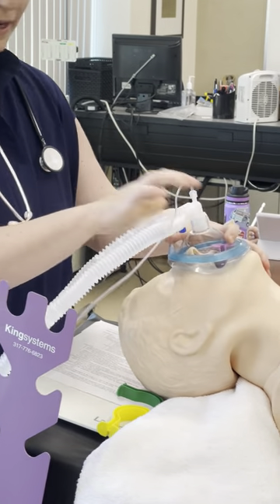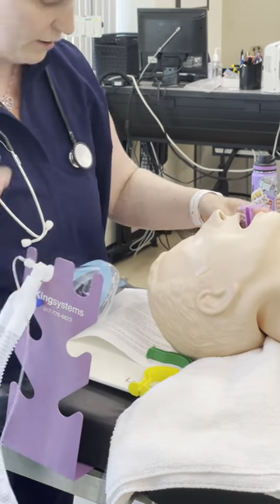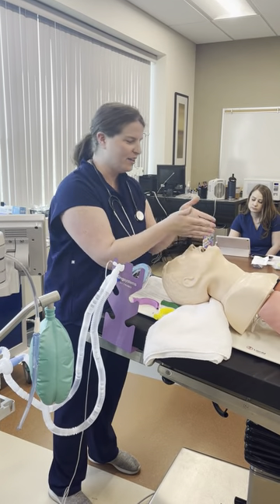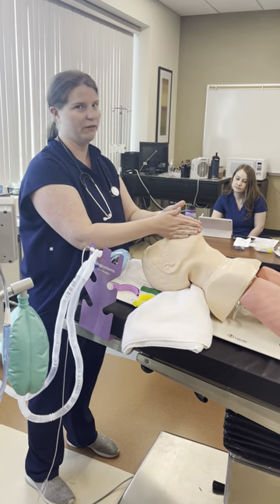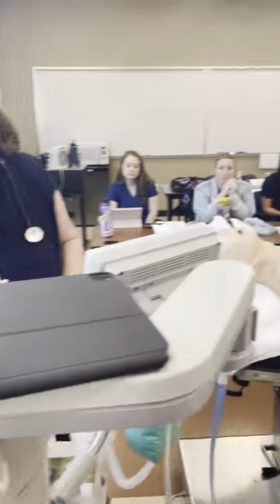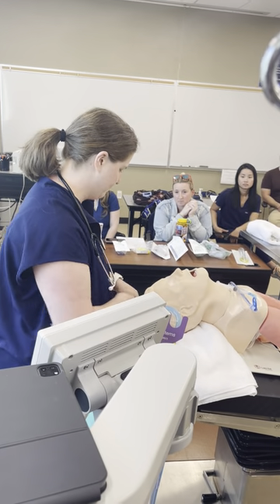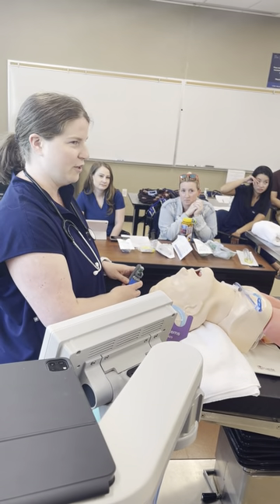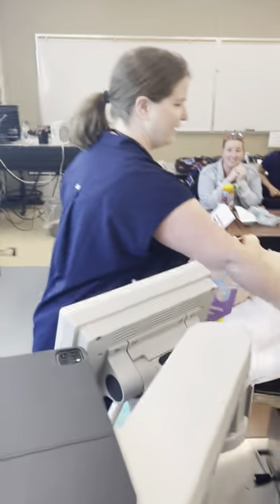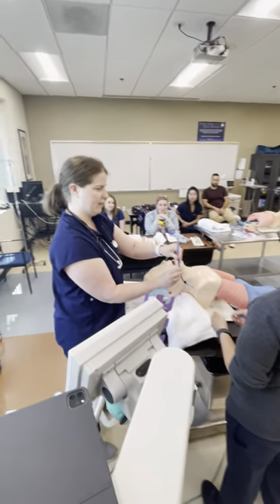With intubation, it's hard for you to see what I'm seeing in the mouth, so I'll articulate what I'm doing as I go — feel free to shout out questions. As I'm ventilating after induction, I bring my equipment over. I'll need an assistant for the intubation — when I ask you to pass the tube, hand it to me like this.